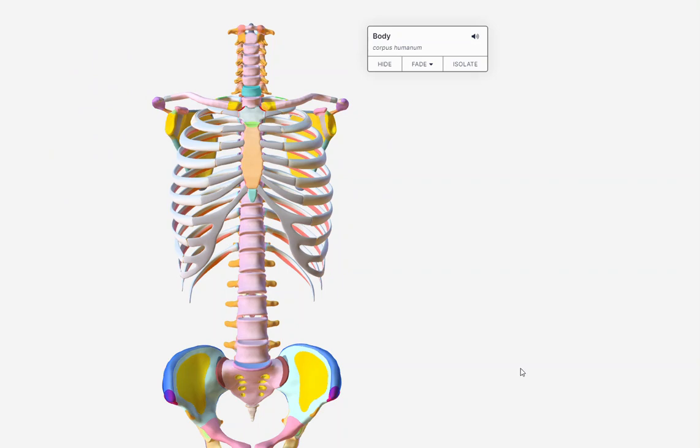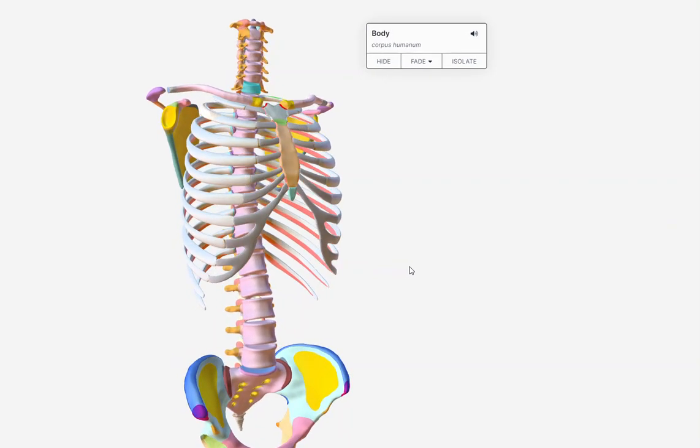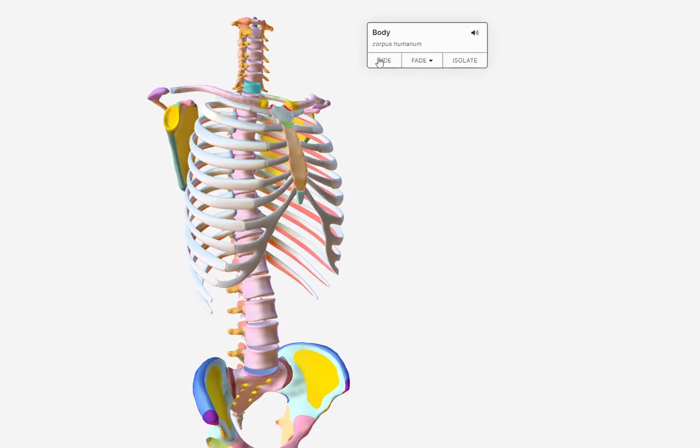So anterior posterior projection. We are going to rotate our patient's left side, their back, against the IR, or our imaginary Bucky. So that would be a posterior oblique. The posterior side's touching the IR right now. So I'm going to rotate the left shoulder toward our upright Bucky or table, posterior side.